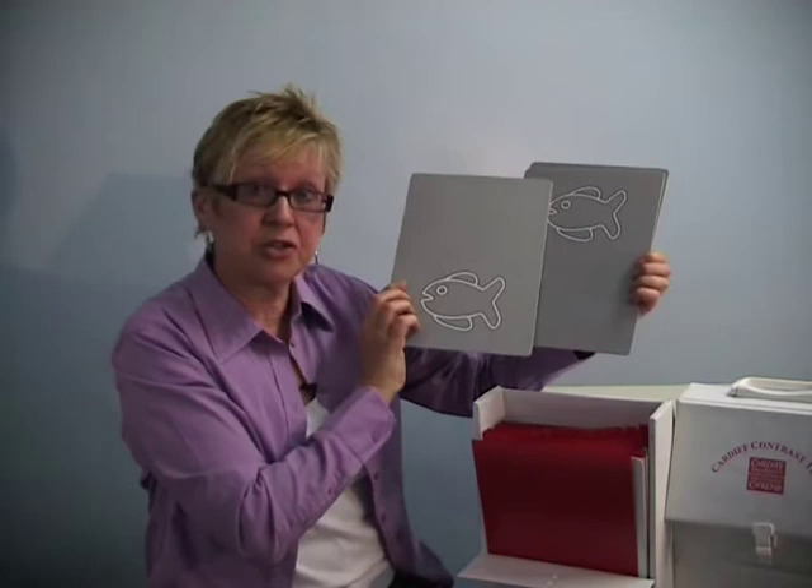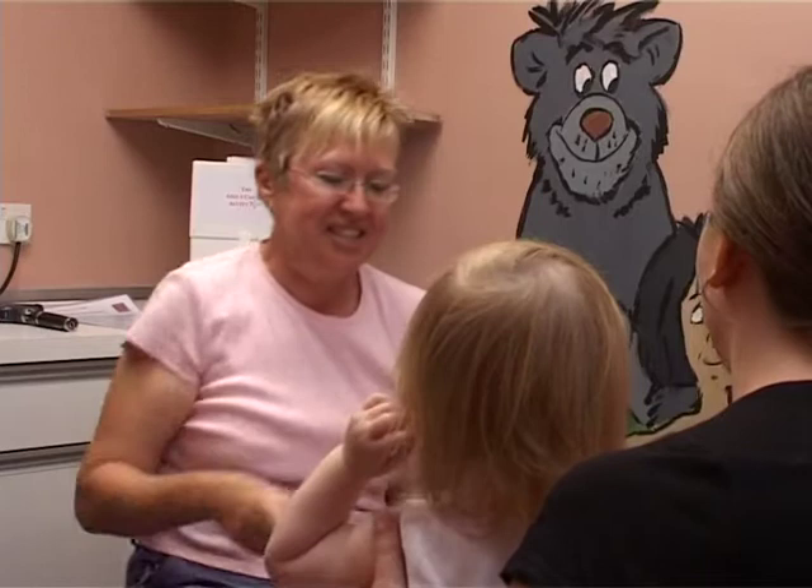If we're correct on both cards, we can then proceed to the next finer level of acuity. The test is calibrated for two distances: 50 cm and 1 m. We need to use those quite close working distances for two reasons: first, when we're working with young children it's very difficult to get their attention from a long distance; and secondly, we need to be close enough to be able to judge the child's eye movements accurately.